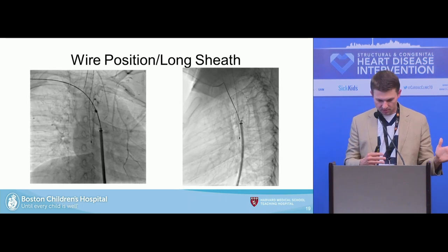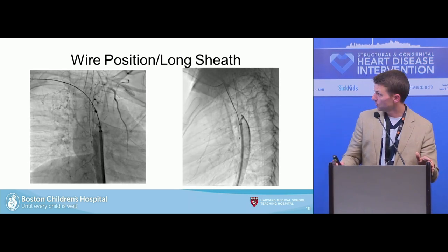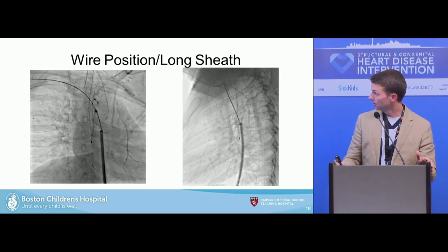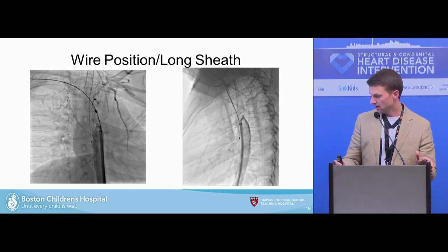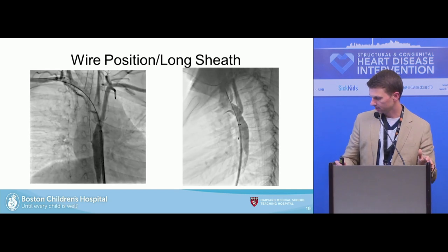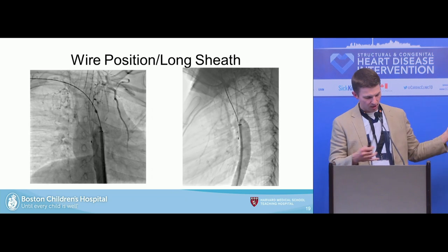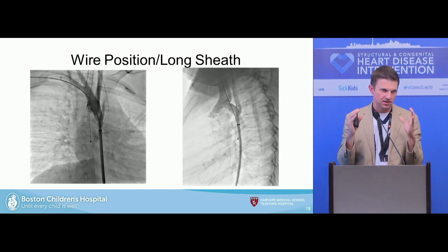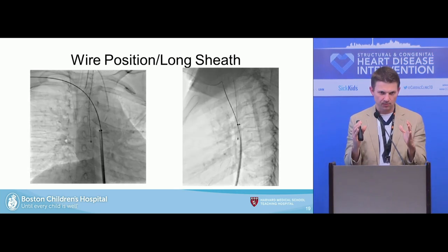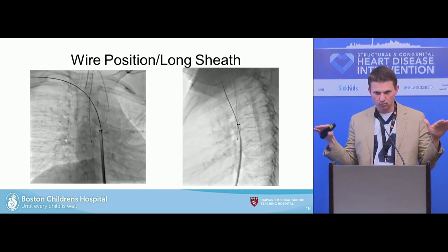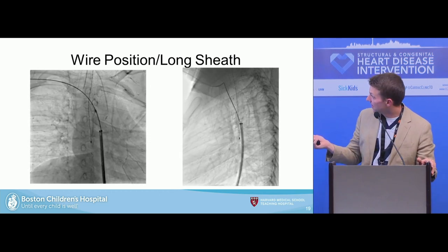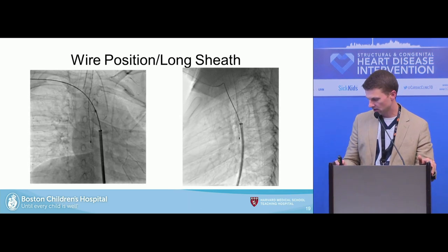You're going to secure your wire position in the right subclavian, usually accessed with a multipurpose catheter. Amplatz super stiff wires — if you're way out there, you don't necessarily need a bend; it'll be a nice straight course. We take an additional picture with the sheath we'll use for the intervention — in this case a 9-French flexor sheath. By doing so, you can truly establish your landmarks for where you're going to land your stent. I was taught early on: if you have room to place a stent, choose landmarks and nail that location perfectly. In this case, we're aiming not to jail the vertebral artery, but we will have to jail the subclavian.